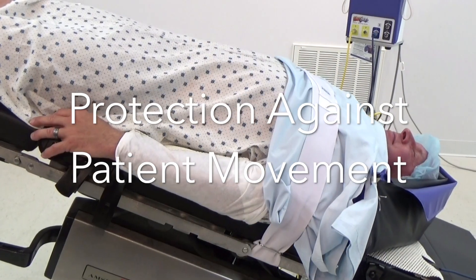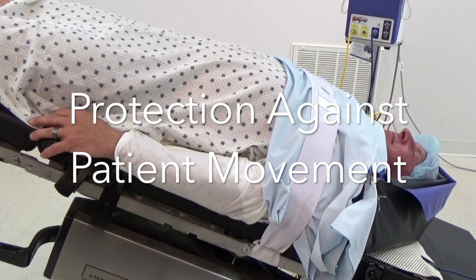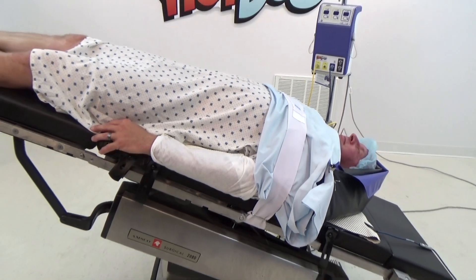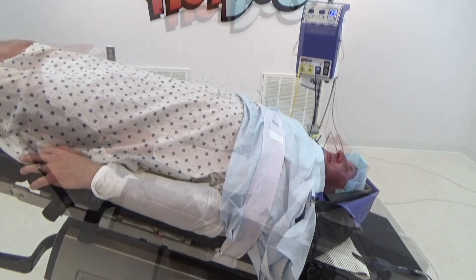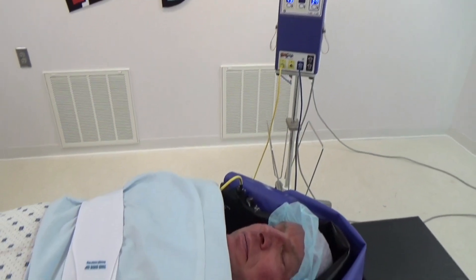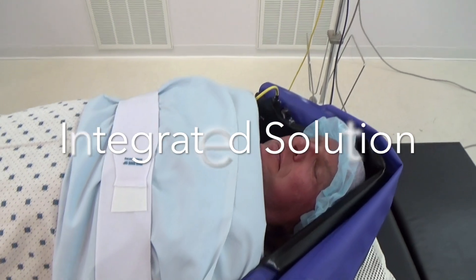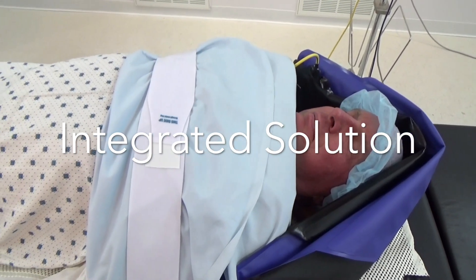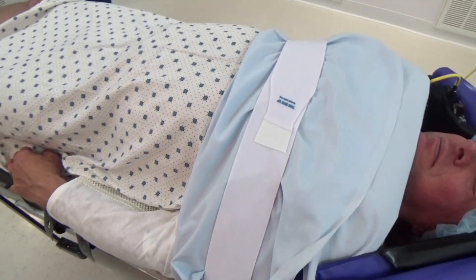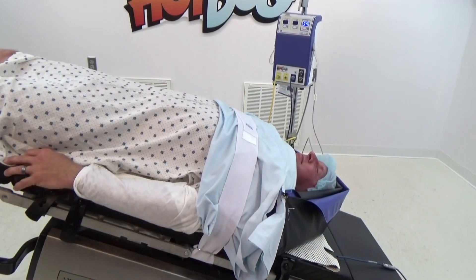Protection against patient movement — a friction-based solution that meets AORN recommendations. Waffle Grip evenly distributes friction and mechanical grip to eliminate localized pressure points and shearing forces, and provides an integrated solution combining patient warming and securement with one easy-to-use and cost-effective system for enhanced efficiency.